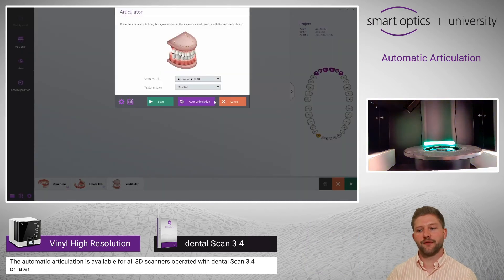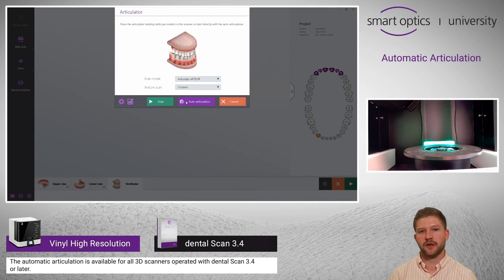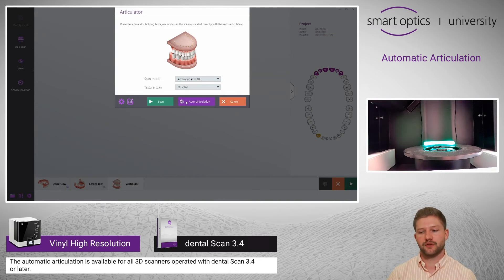The scans are now finished. You can see a new button over here which is called auto articulation. We have developed a special algorithm which finds the perfect occlusion.